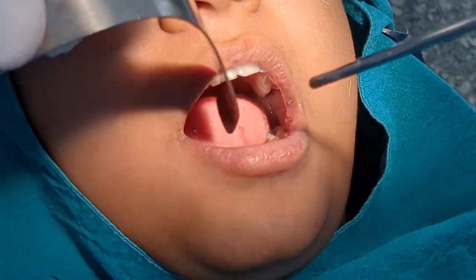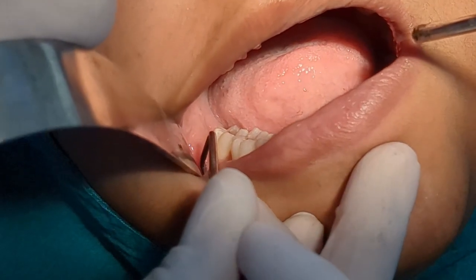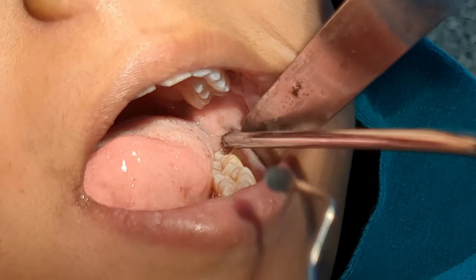As always, I'm going to show the patient what actual pain feels like on the opposite side. The patient has reacted to the pain — now the patient will be able to differentiate between pain and pressure.